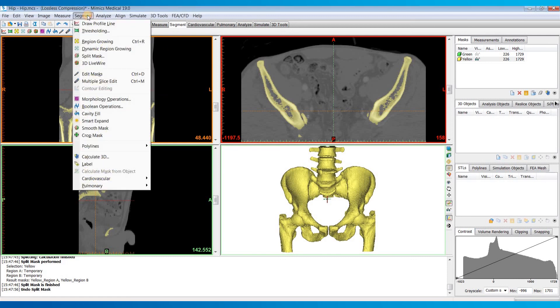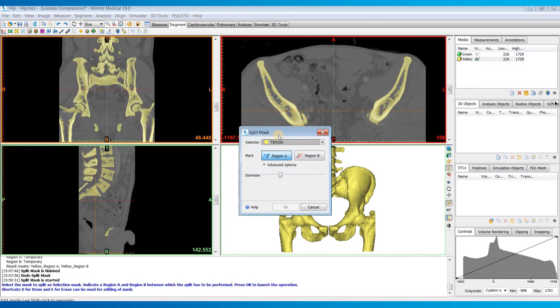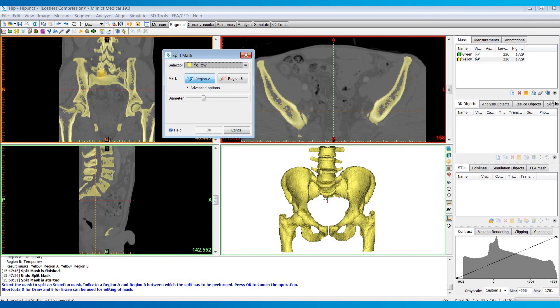I'm going to go to the segment menu and open up the split mask tool. This tool works by marking the region that you want to split off in region A and everything else in region B. So let's say we want to split off the sacrum from the rest of the pelvis — I'll just mark that in region A.